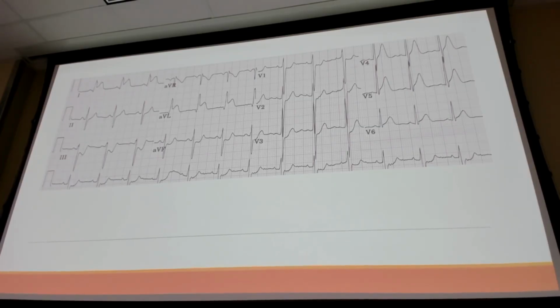You guys probably have the answer on your slide, right? Yeah, this is going to be your lateral. So what leads do you see the elevation in? You've got I, aVL, V5 and V6 definitely, maybe V4 on there. And then where do we see those reciprocal changes? Yeah, the inferior leads, right? So a little bit in 2, definitely in 3, definitely in aVF, good.